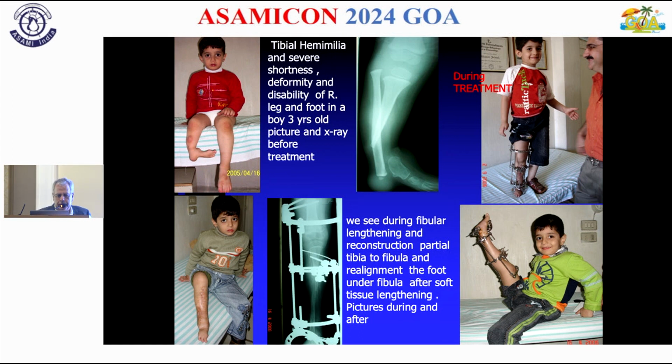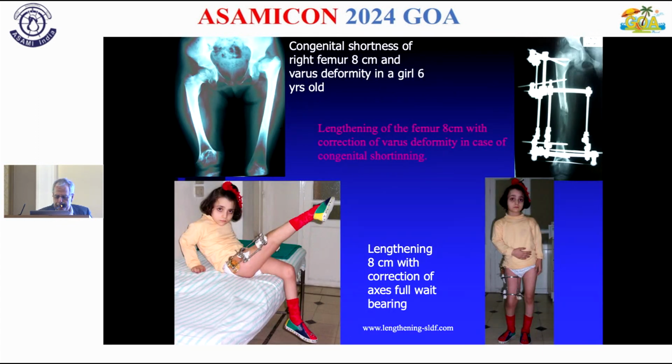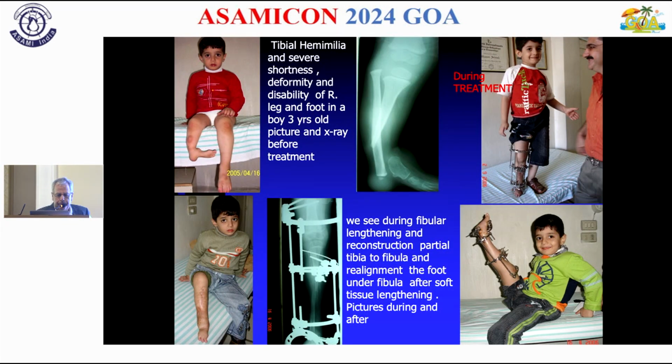This is during treatment. We used the fibula for the tibia, and had full length at the end of the treatment, and also corrected the ankle joint.